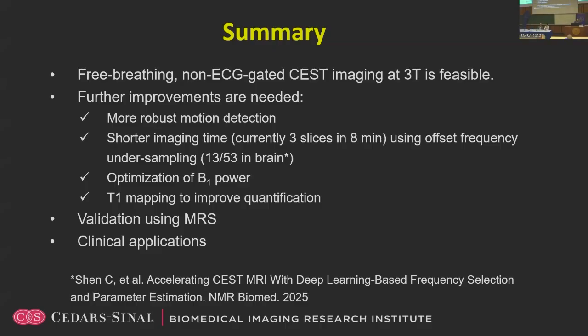So in conclusion, we have tested this free-breathing, non-ECG-gated CEST imaging based on the multitasking framework and 3T, and show some interesting results, but this is not the end, of course. A lot of further improvement is needed.